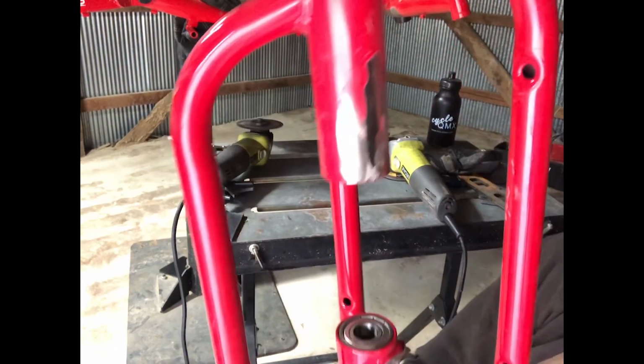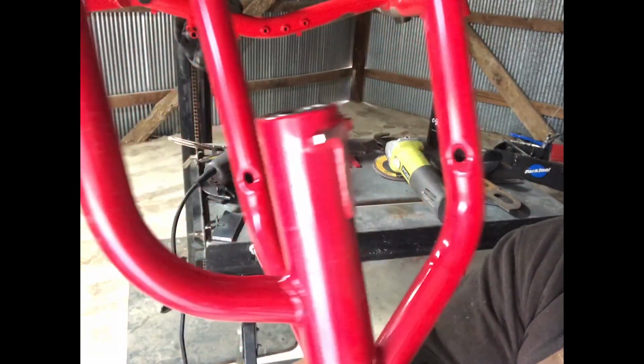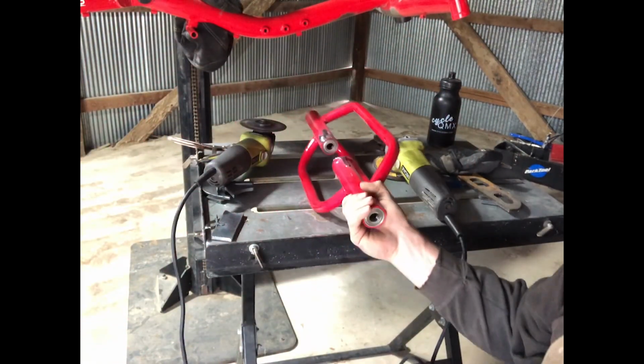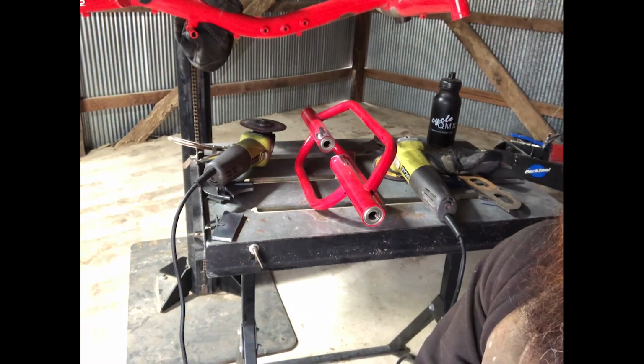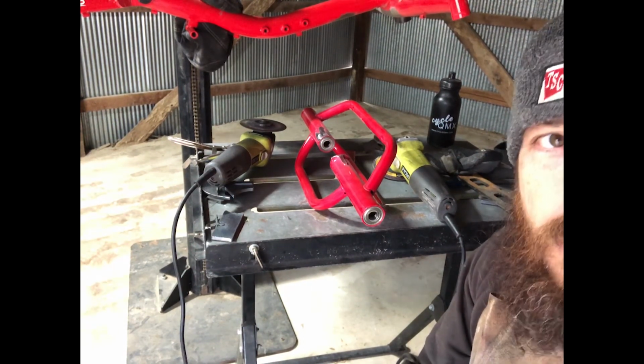All right, there's one side all cleaned up. I just got to do the other side. I'll go ahead and do this off camera, save time, and then I'll come back and get these tacked on.